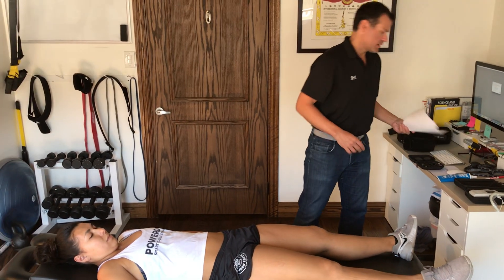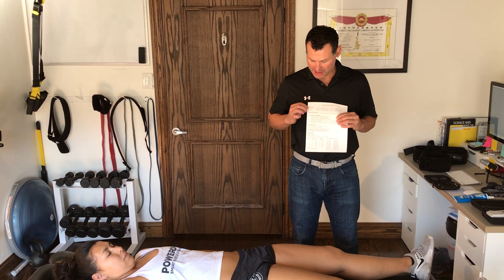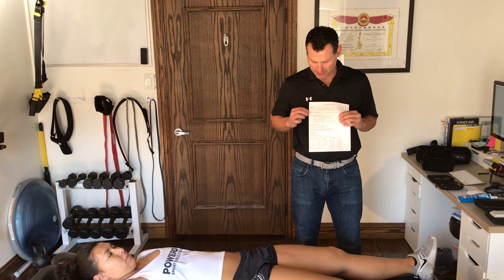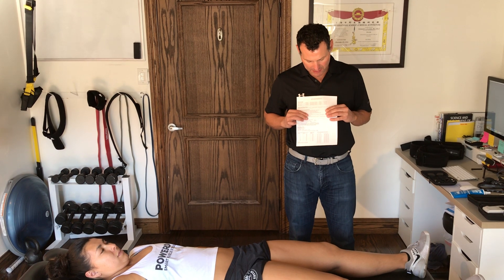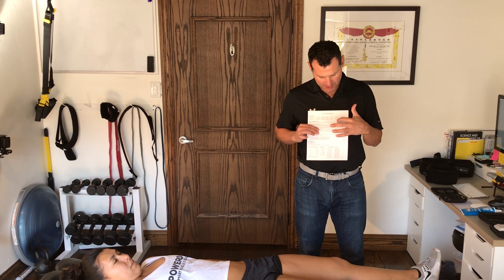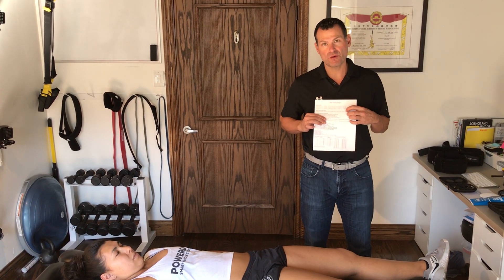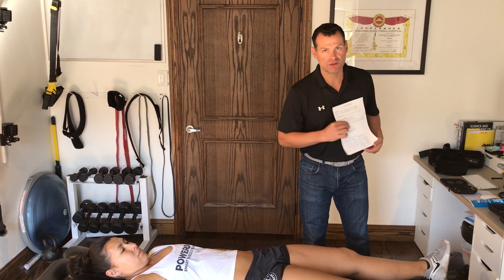If I look on my worksheet and go to basic setup and look at the cuff sizing chart, I can see that 27 inches is going to be somewhere between cuff size 3 or cuff size 4. I'm going to go with cuff size 4 because I want to make sure that there's overlap and that it fits nicely.